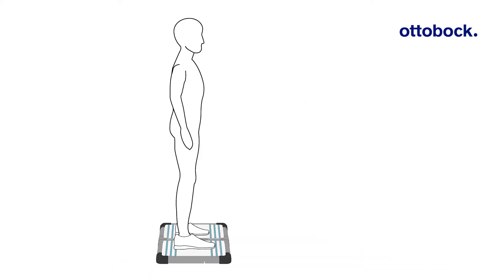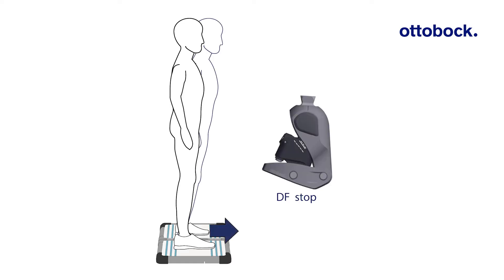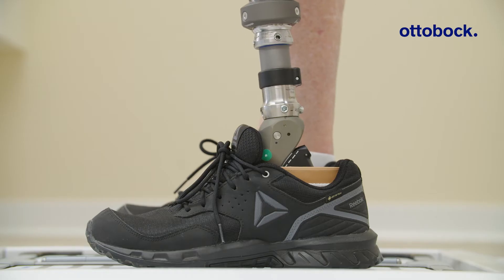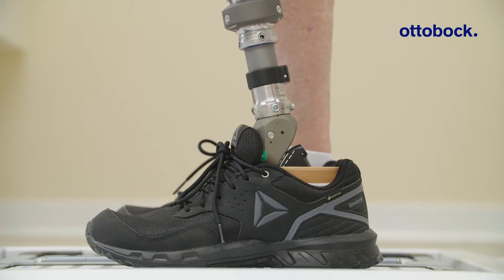If the user has the feeling of falling forwards, or the dashed dorsiflexion stop line is visible, move the prosthetic foot in the anterior direction. If the user has the feeling of falling backwards, or only the dashed plantar flexion stop line is visible, move the prosthetic foot in the posterior direction.